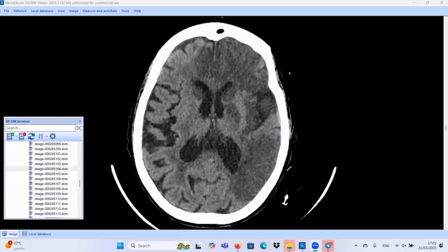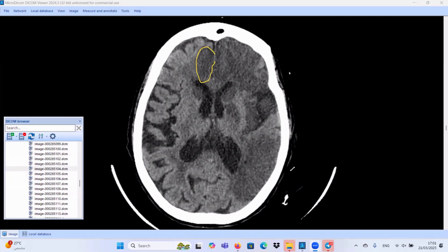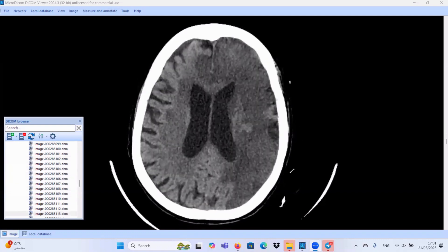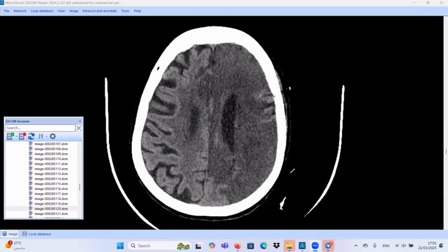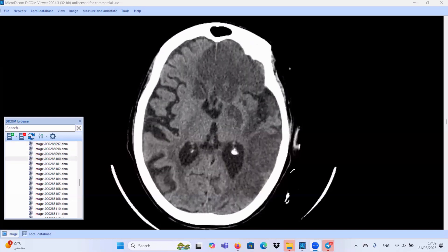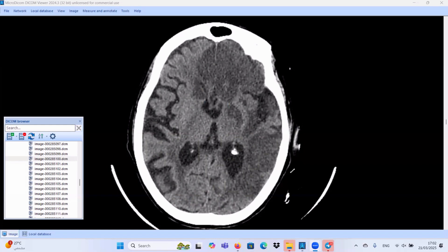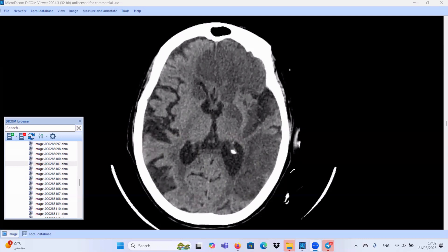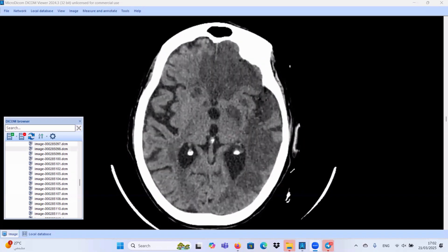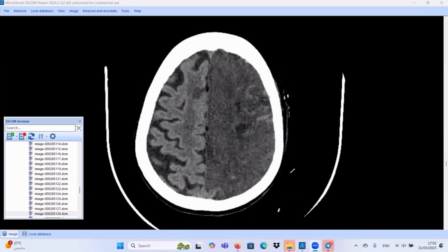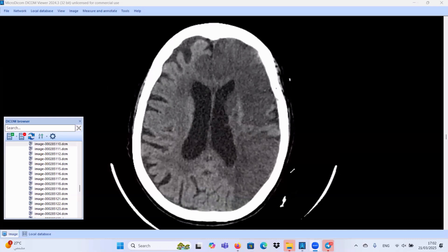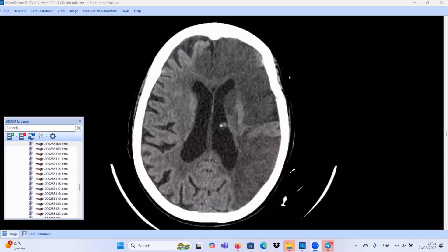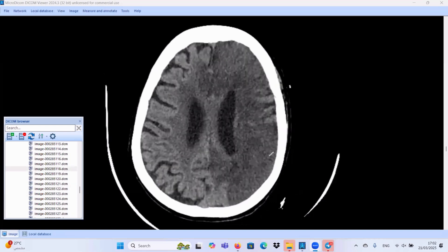Let's go to the right side. We have also right side, right paramedian, hypodense area at the frontal region. We have also here at the high frontal region, we have hypodense area at the paramedian supracallosal location. We have also the caudate nucleus is hypodense. The caudate nucleus is supplied by the middle cerebral artery and its inferior aspect is also supplied by the anterior cerebral artery. So, we have here, in conclusion, we have acute cerebral infarction along the left middle cerebral artery, left anterior cerebral artery and to a less extent right anterior cerebral artery.